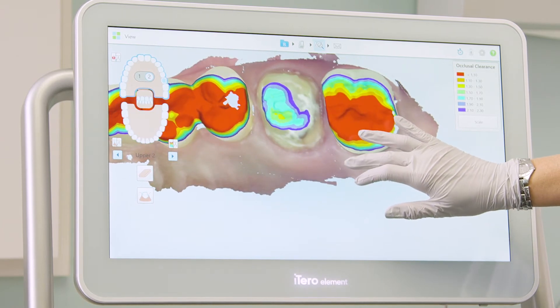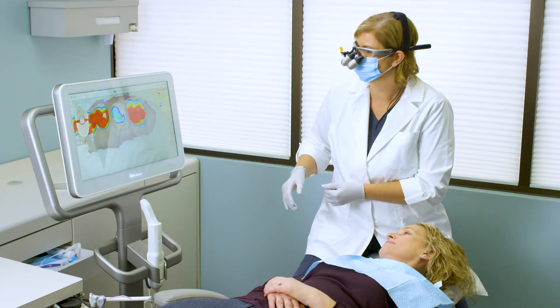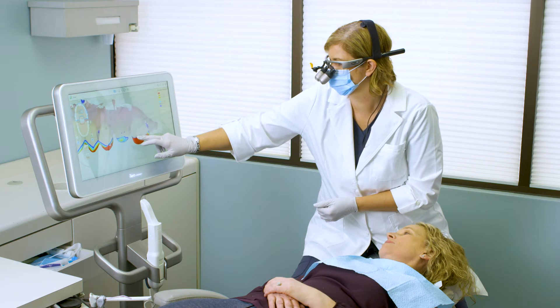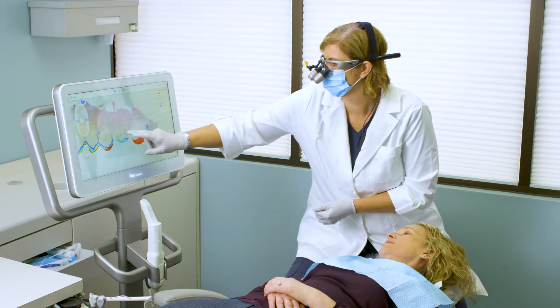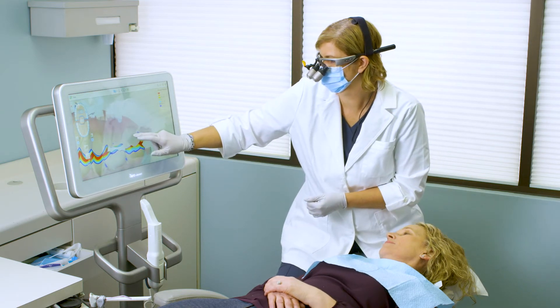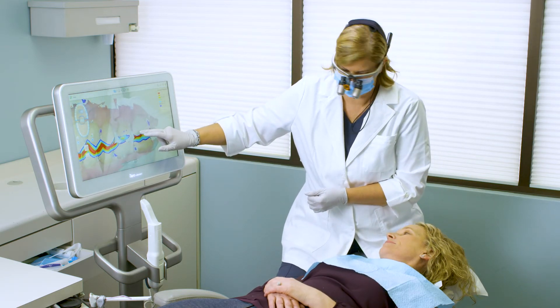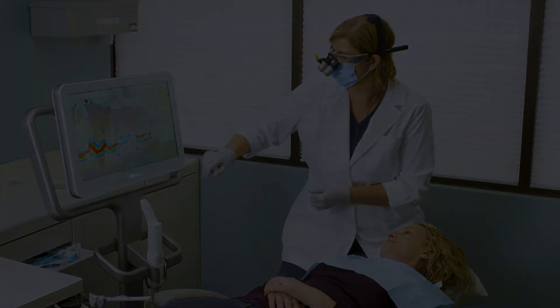The eraser tool on the iTero Element scanner is convenient and makes adjusting my digital model easy. It helps to ensure that my restorations fit great.